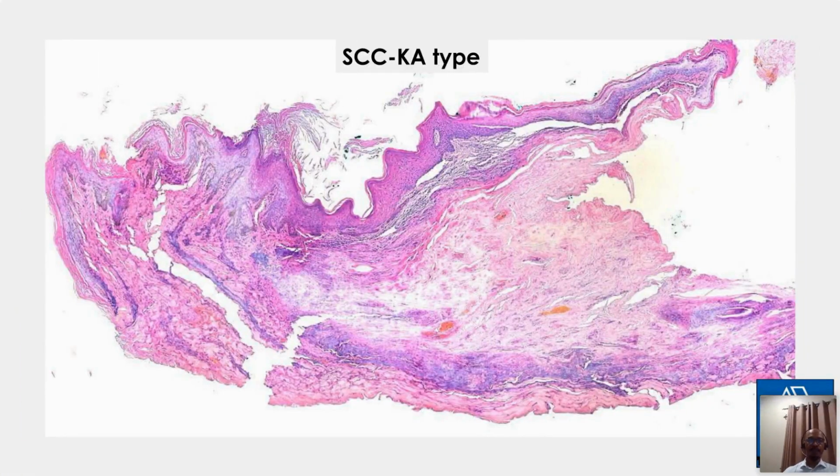Okay, this was a keratoacanthoma, which was left out to dry a little bit, not intentionally, obviously, before it was put in formalin. And unfortunately, when we process tissue that has been left without formalin for a while, this is what you end up with. There is distortion of the architecture.